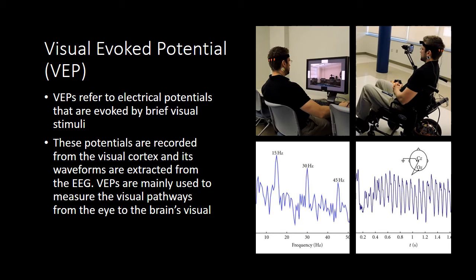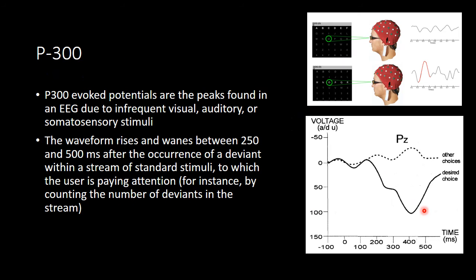This is one of the applications of modern BCI systems. The other type of BCI systems is based on the concept of P300 evoked potentials, which follows the concept of independent BCI. It is called independent BCI because it does not use any eye movement or any other muscles or brain output pathways for implementation. First, let's look at what P300 is.